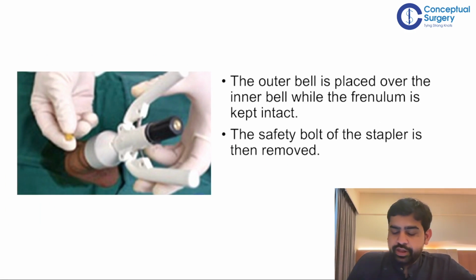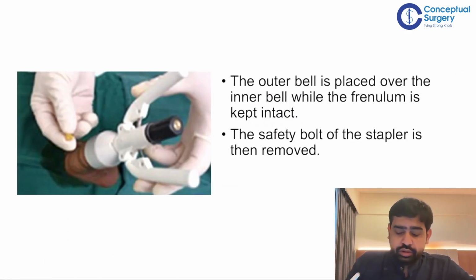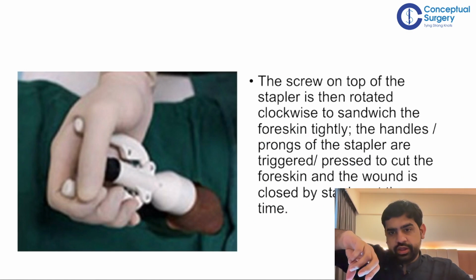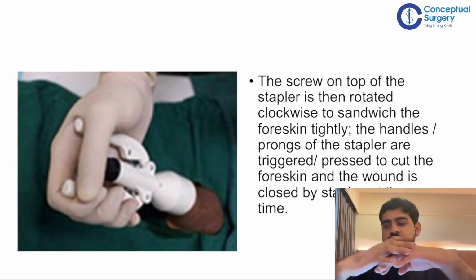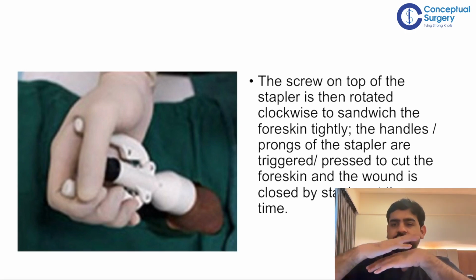The outer bell is placed over the inner bell while the frenulum is kept intact. The safety bolt of the stapler is then removed. This yellow colored thing is the safety bolt. Then this black colored knob you're seeing, you need to screw this stapler. The screw on the top of the stapler is rotated clockwise to sandwich the foreskin tightly, so that the skin gets compressed. This is similar to any stapler: we have to tighten the screw so that the skin is compressed between the two edges.